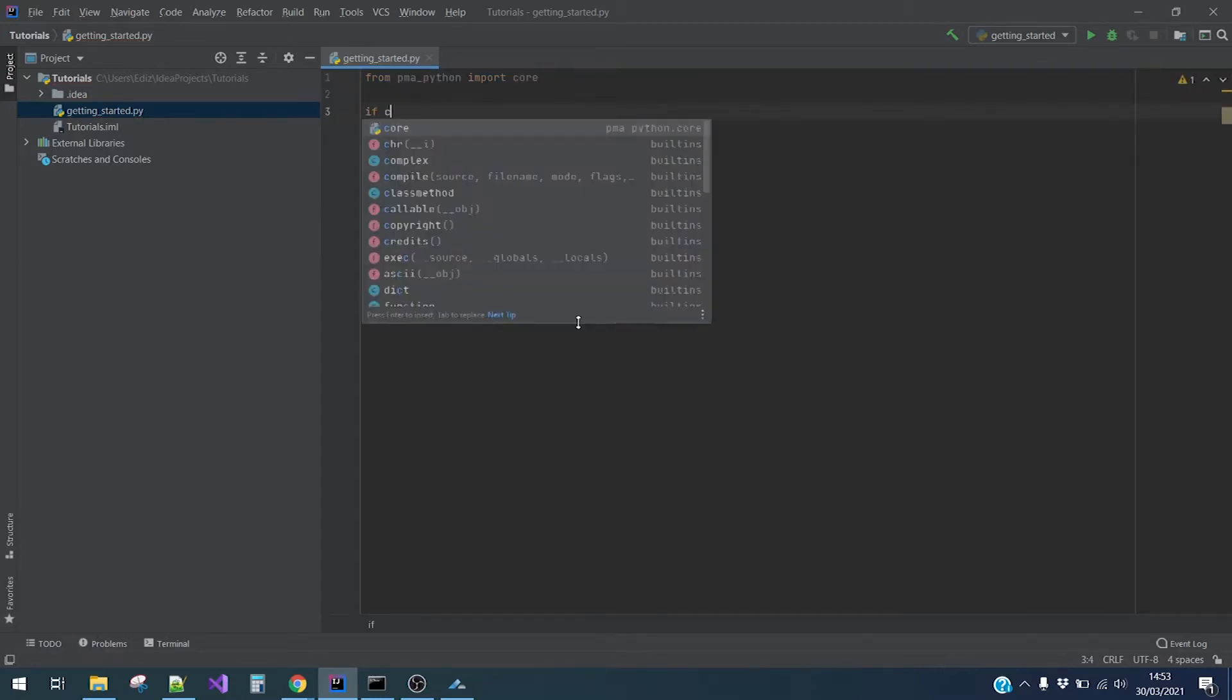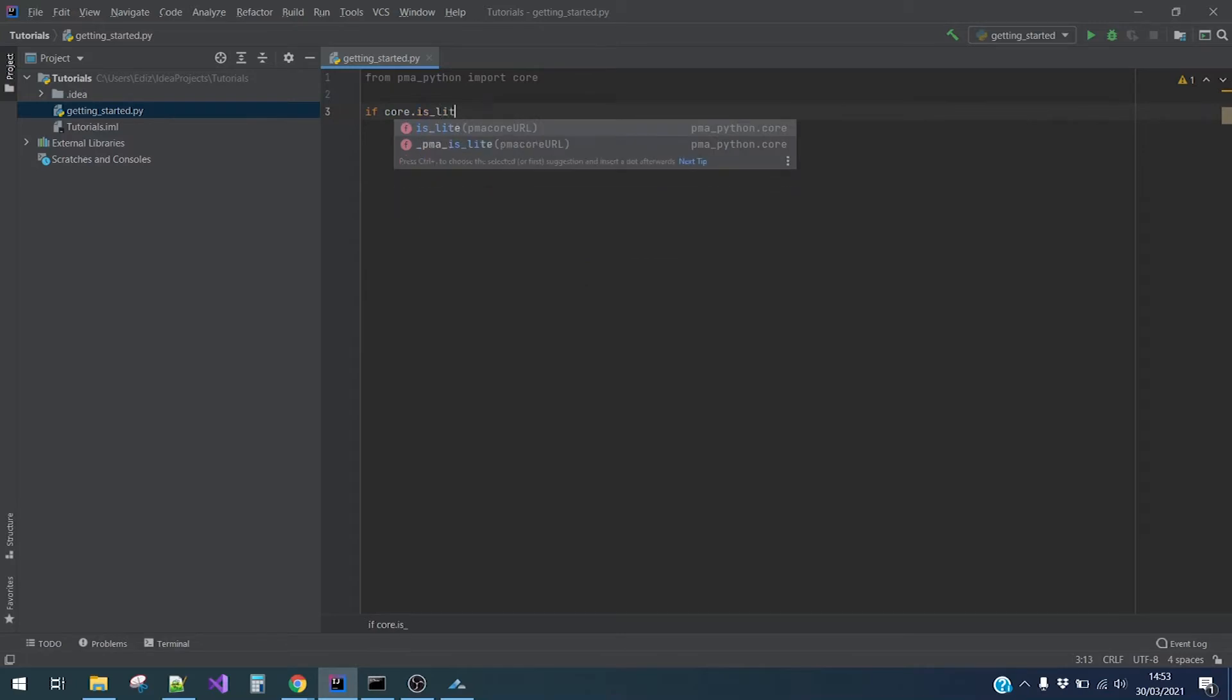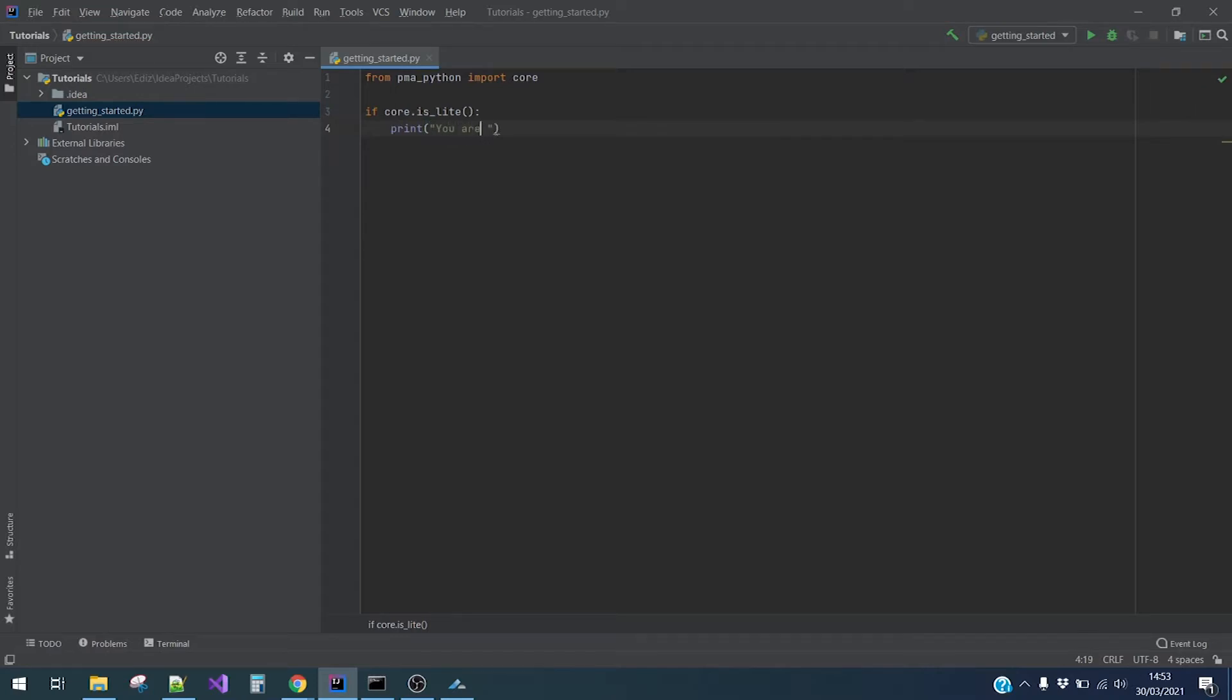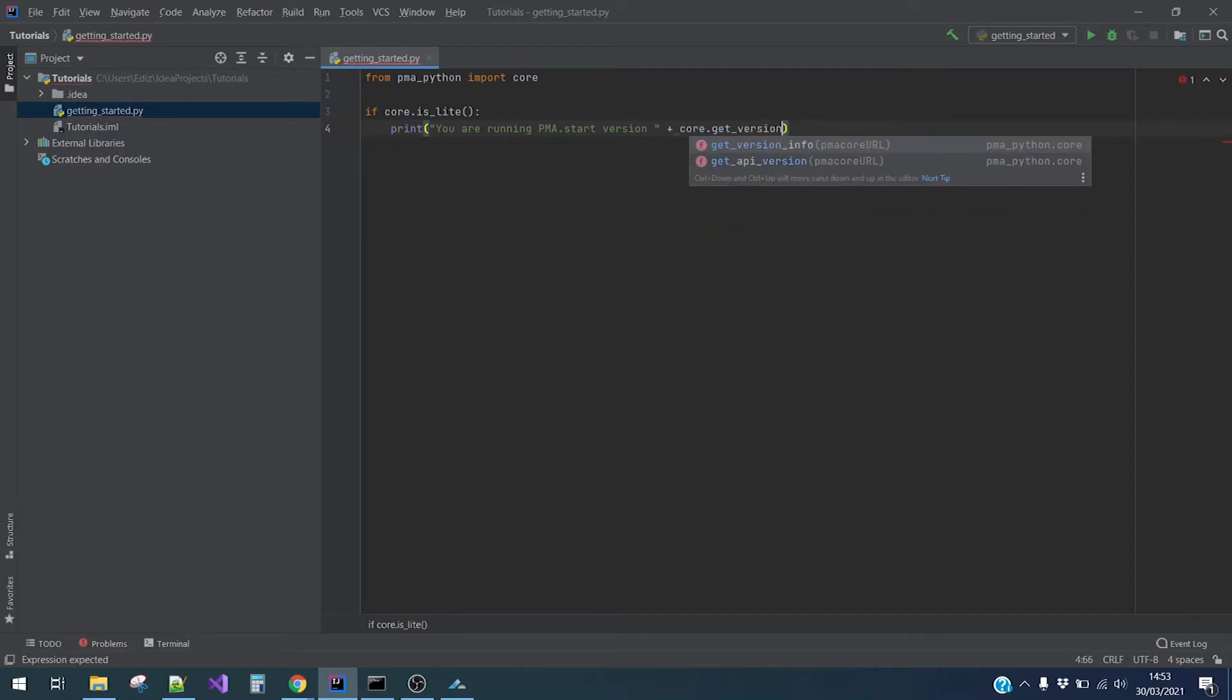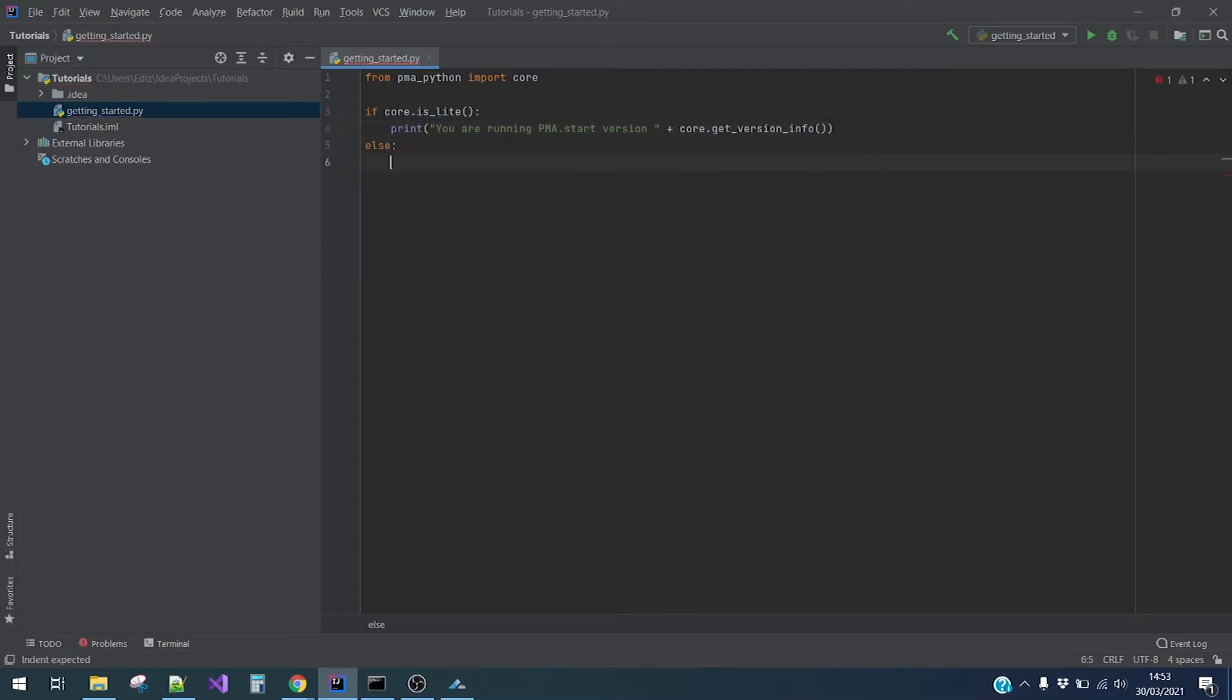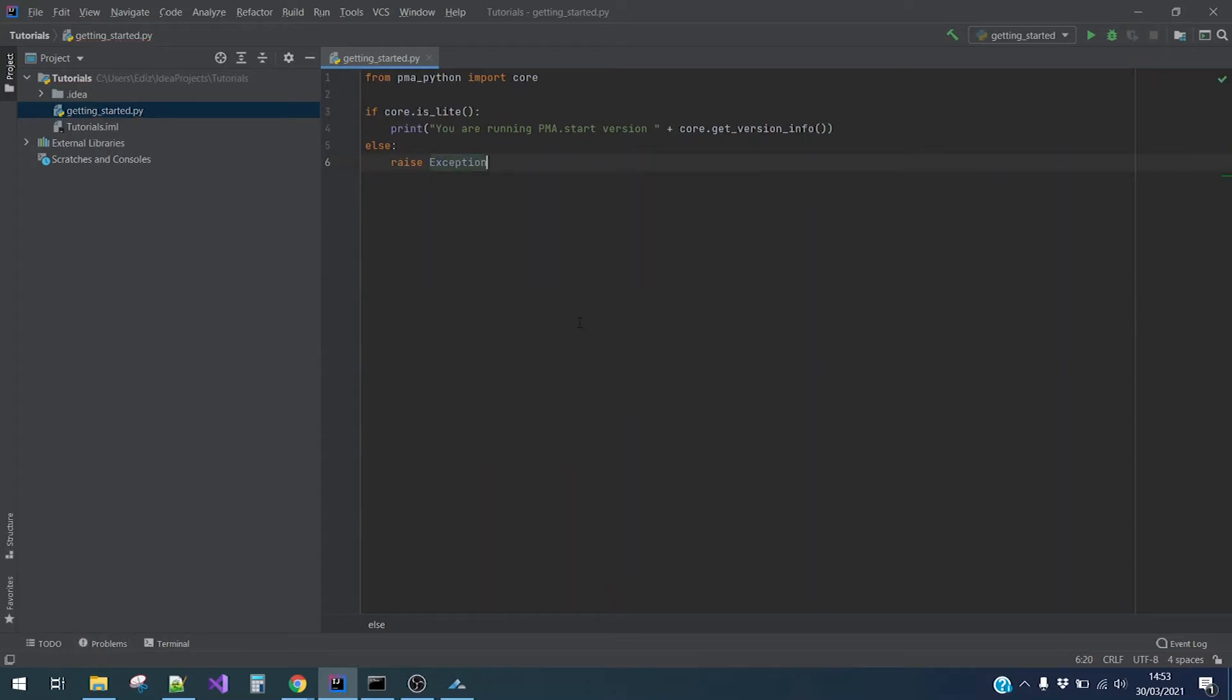Then we will write an if-else clause for quickly checking if everything is running smoothly. So if core.isLite, we will print you are running PMA start version plus core.getVersionInfo. Else we will raise an error saying that PMA start has not been detected.